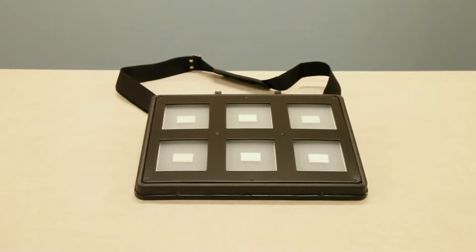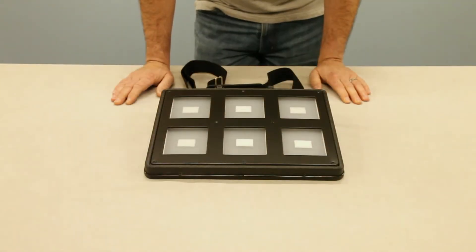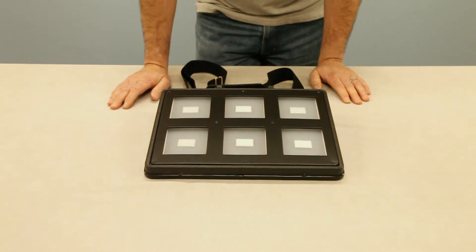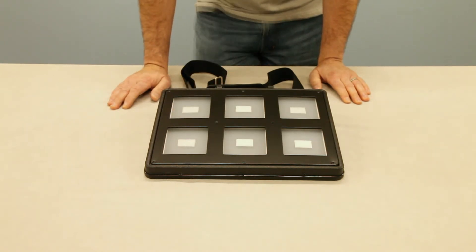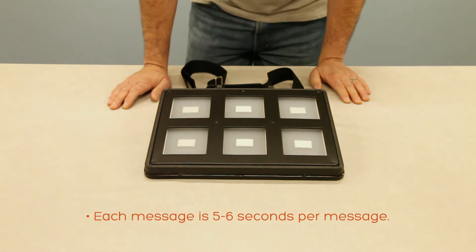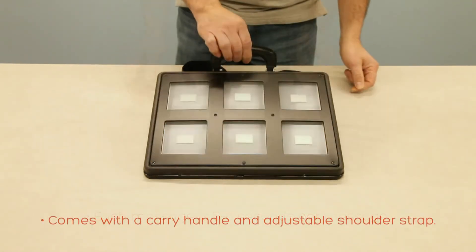This is our Symbol Communicator for the Blind, item number 4040. This communicator is a six-message times six-level communicator with a total recording capacity of 36 messages, approximately five to six seconds per message.